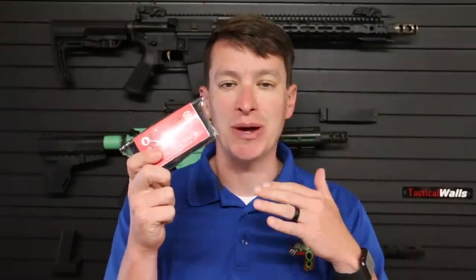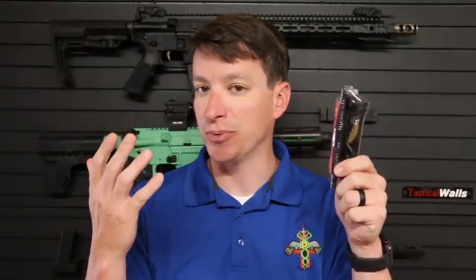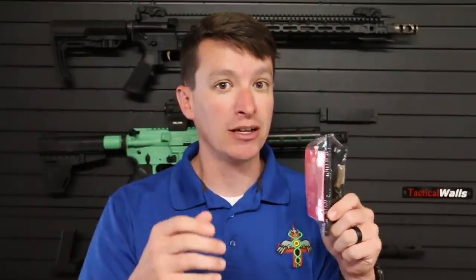Welcome to another video from Skinny Medic. I have the TMT tourniquet here — the Tactical Mechanical Tourniquet, made by Combat Medical. This one recently got recommended by the TCCC committee, which is a great thing. There's lots of data and research behind that, so we're going to take a look at it.